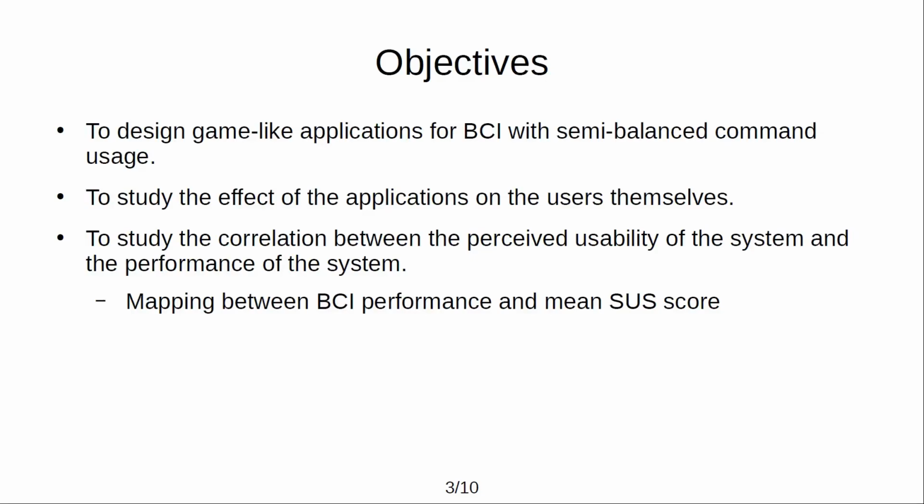The third objective was to study the correlation between the perceived usability of the system and the performance of the system, therefore allowing us to have a mapping between the BCI performance and the mean SUS score, which finally will allow us to do a prediction of the mean SUS score that our system will receive for a given BCI performance.